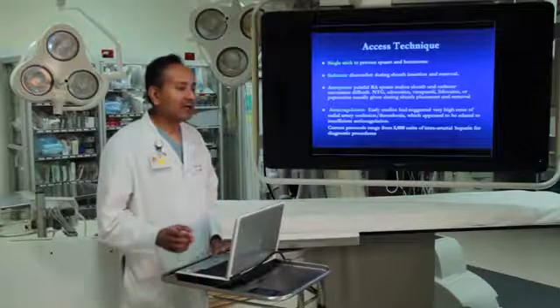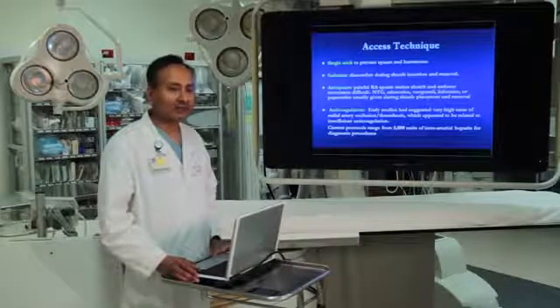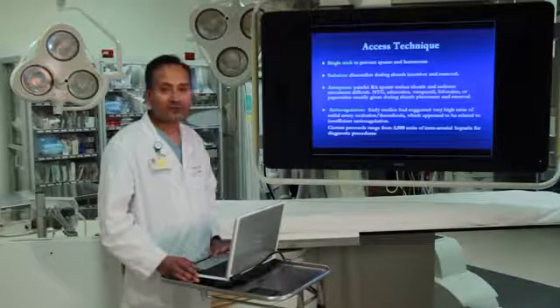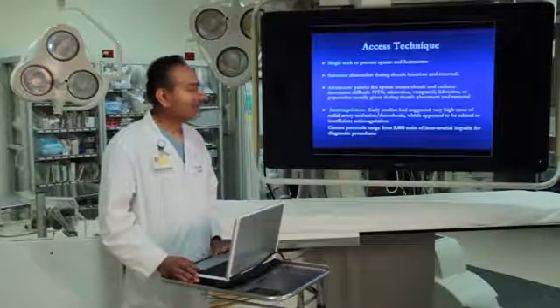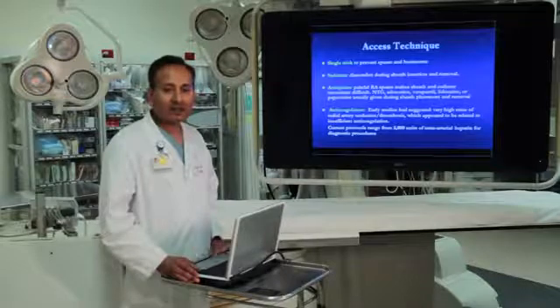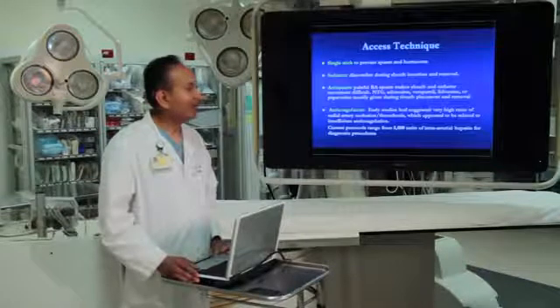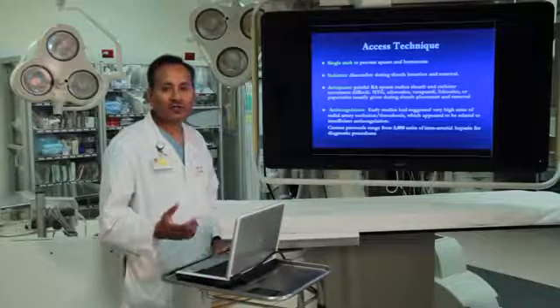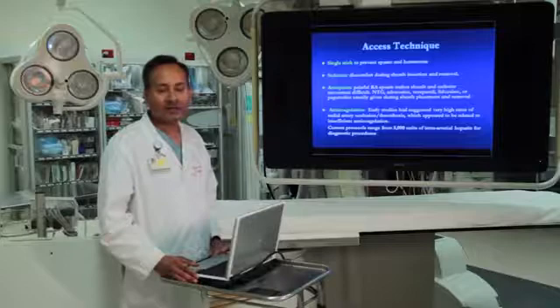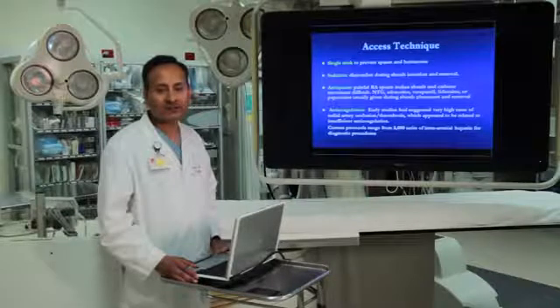And we also use anticoagulation in the form of antiplatelets. Heparin can be given intra-arterial or intravenous. Angiomax can be introduced as an anticoagulant agent. What we find, because of the pain from intra-arterial injection of heparin, is that we give heparin intravenously, weight-based, ranging from 40 to 60 units per kilogram.